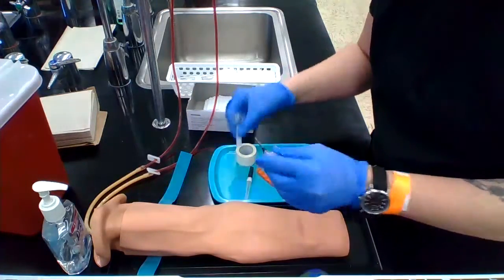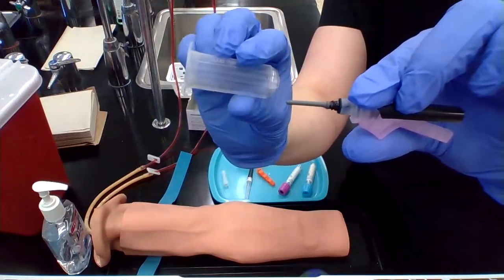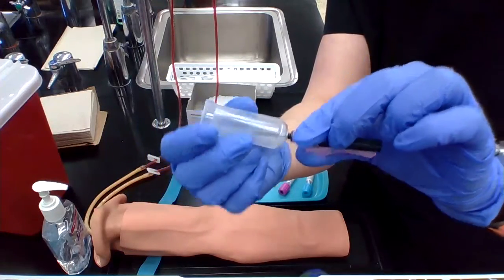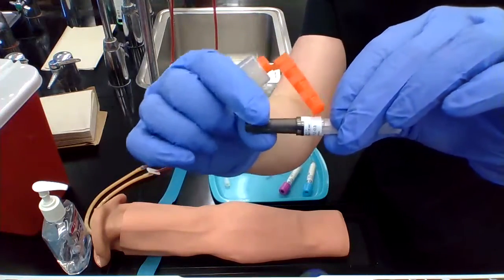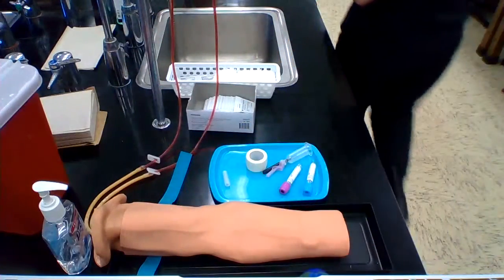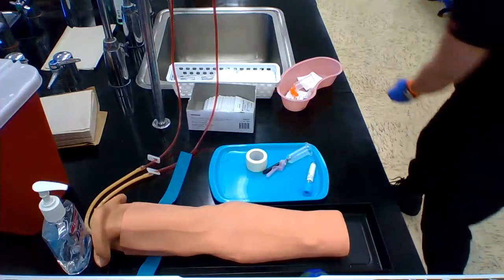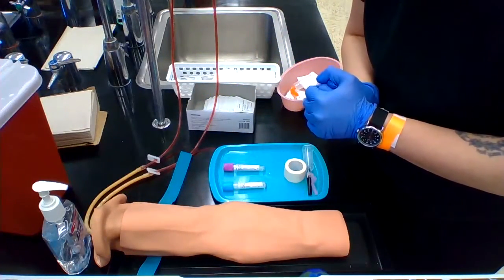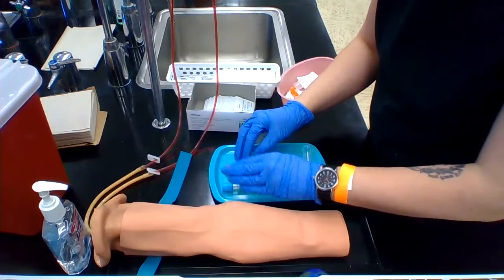My needle has a safety device, so I'm going to choose a holder that doesn't. Inside the holder there's a needle — when you push your tube onto it, that rubber part will be pushed back, the needle will puncture your vacutainer and let the blood in. You just screw that in. I'll also get my tubes in order. I'll post another video about tube order — you can remember it using a visual portrait or acronyms. I'm going to draw blue first and then purple.